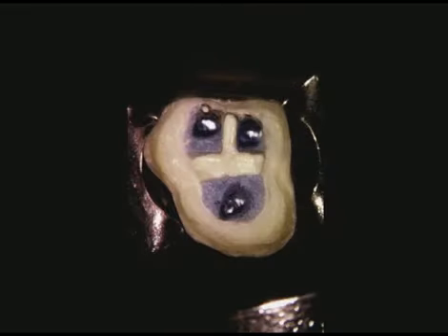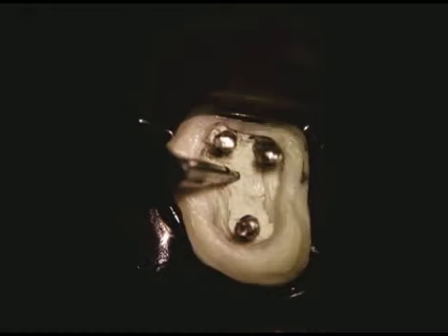The core is sectioned buccal to lingual and then central to mesial in order to divide the buildup into thirds. A diamond burr reduces the buildup and provides deeper access into the pulp chamber. A subsequent photograph reveals progressively deeper sectioning with rotary cutting tools, further reduction of the buildup, and a core carefully sectioned into thirds. An ultrasonic instrument is then utilized to progressively eliminate restorative materials to enhance deeper access.